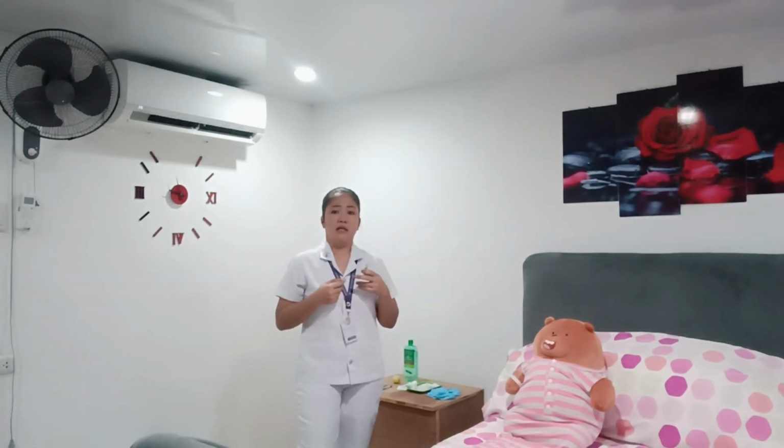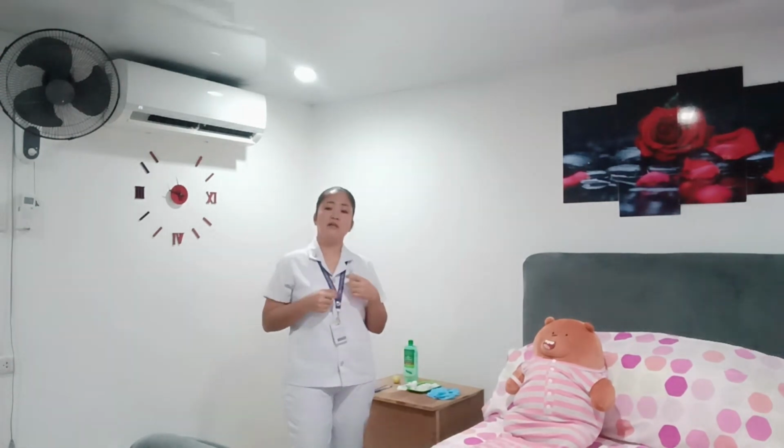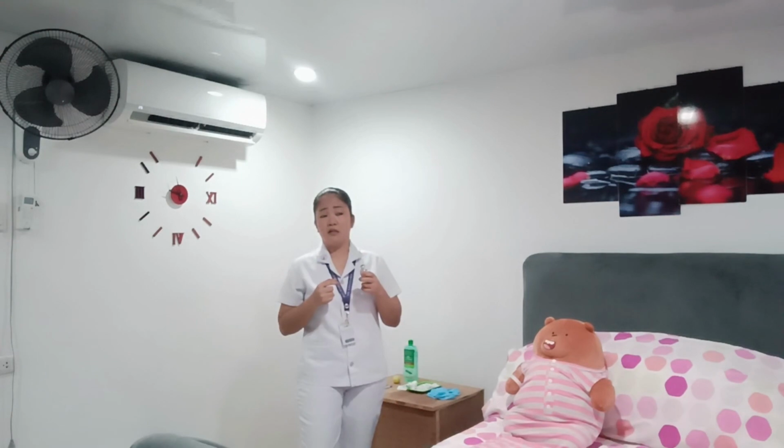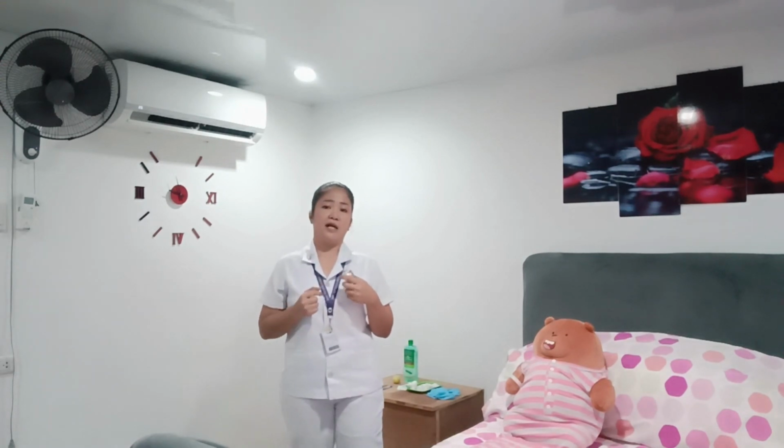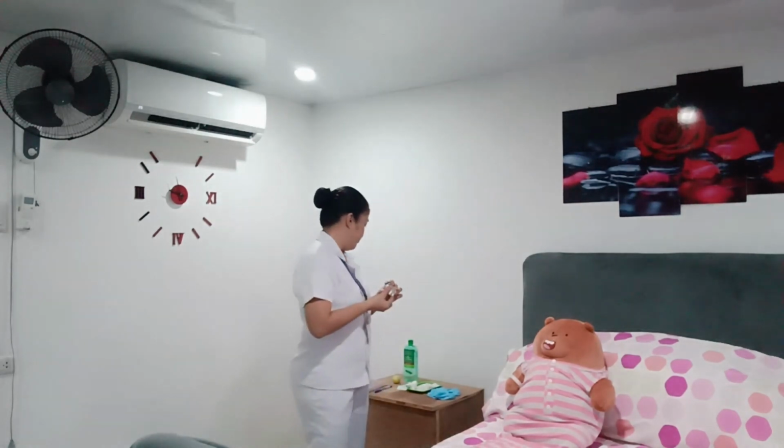If the medicine has been previously opened already, I'm going to withdraw the medicine by inserting air into the vial equal to the desired amount of medication that I'm going to take out from the vial. So let's say I will withdraw 3 cc of the medication. I have to insert 3 cc of air also, to make it easier to take out the medication later on. And take note, we don't have to put the needle inside the vial all the way, but you have to ensure that the tip of the needle is below the fluid level. I'll show you.